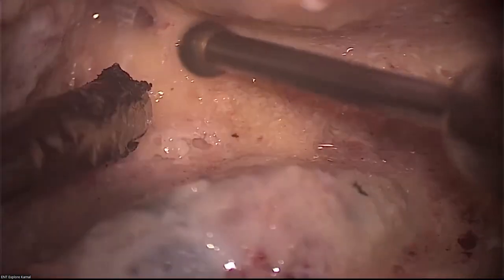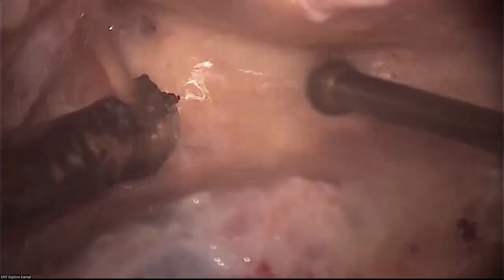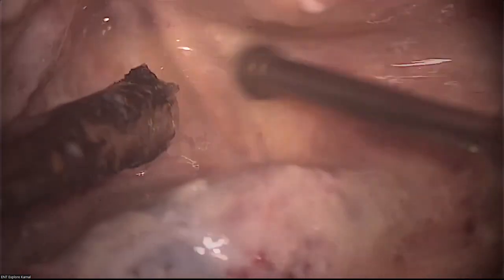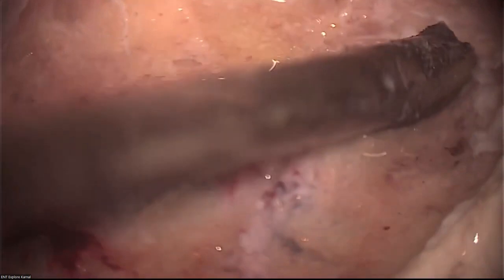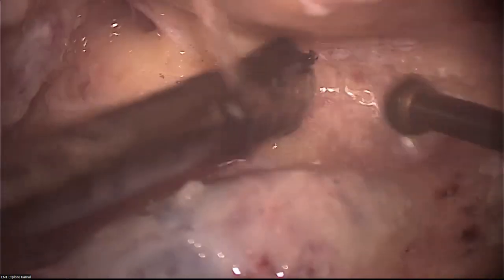Sometimes during this step, the posterior canal wall is more posterior, and the burr may actually hit the posterior canal wall. So what strategy can one use at this point? Canal wall variations you can see from case to case. The curvature of the canal wall may vary case to case.